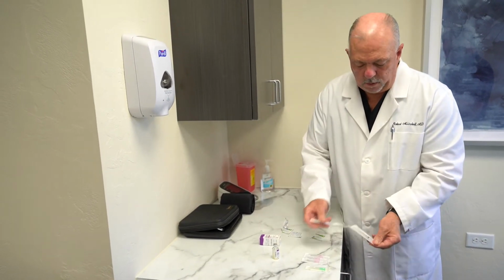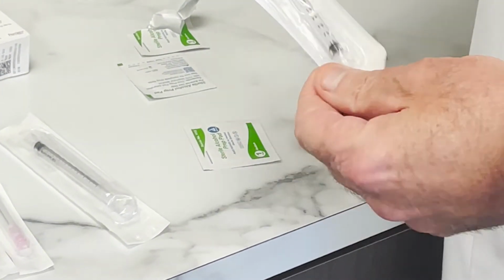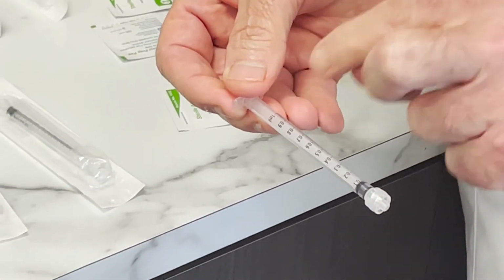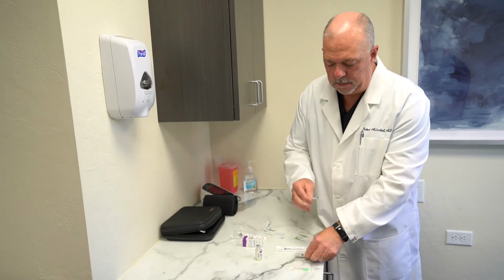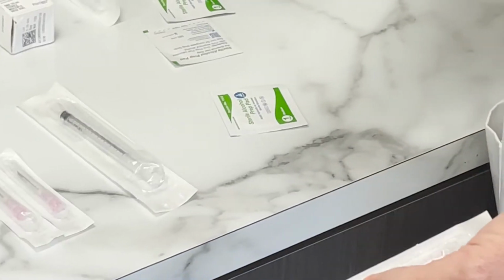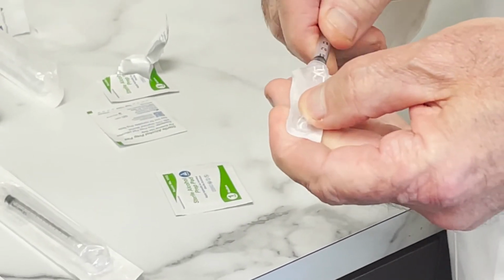You will receive 1 cc syringes, and they will look a lot like these. Each of these syringes is calibrated from 0.1 mil all the way up to 1.0 mil or 1 cc. There are 2 types of needles, 2 sizes. For all, whether it's subcutaneous or intramuscular, we use a larger needle for drawing up the medication. It's typically an 18 gauge needle. It's easier to draw up the medication with this size needle.